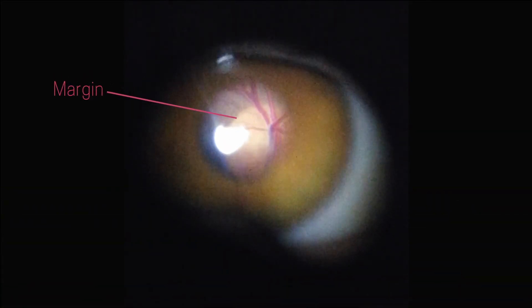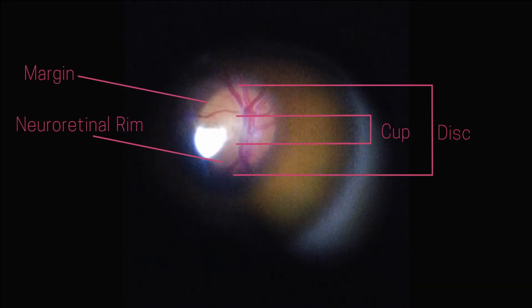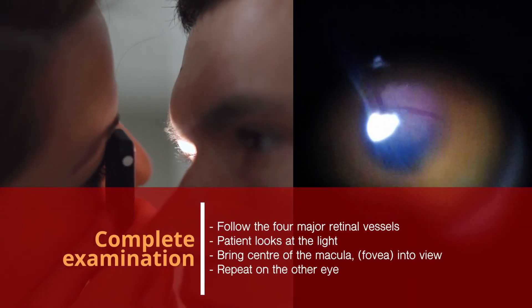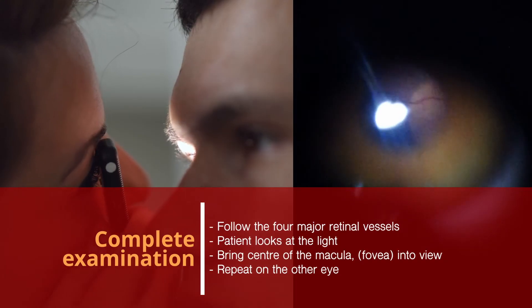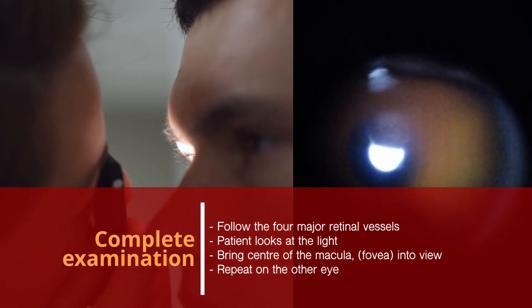Comment on how distinct the margin of the disc is, the colour of the neuroretinal rim and the cup-to-disc ratio. Then look for other signs along the four major branches of the retinal vessels. Finish by asking the patient to look into the light to bring the centre of the macula, called the fovea, into view.